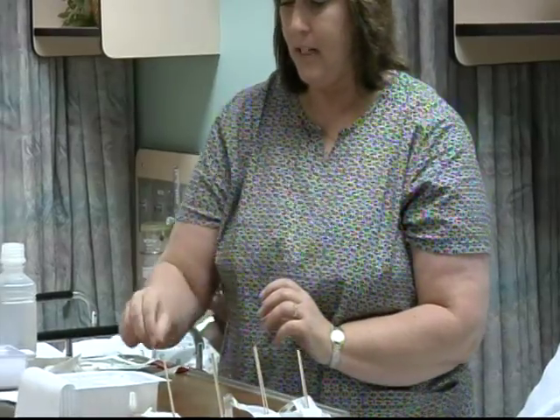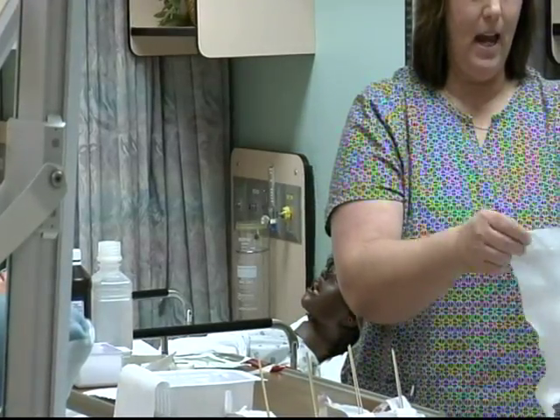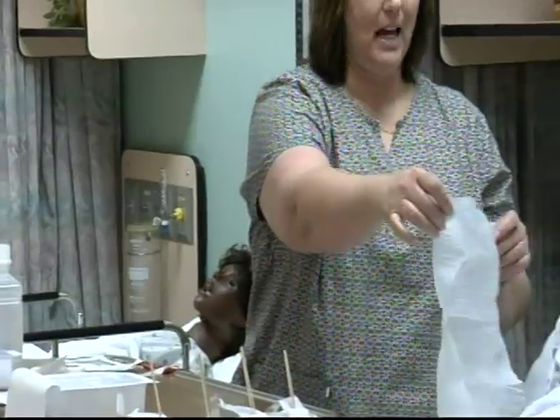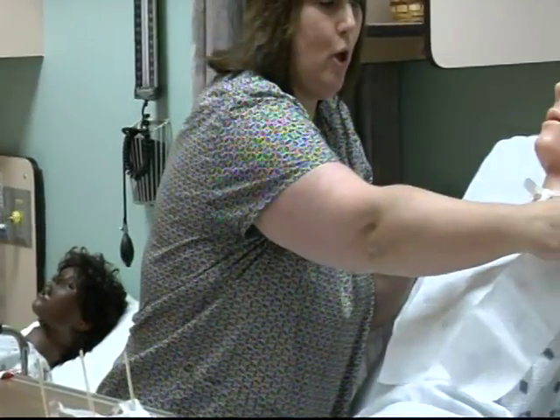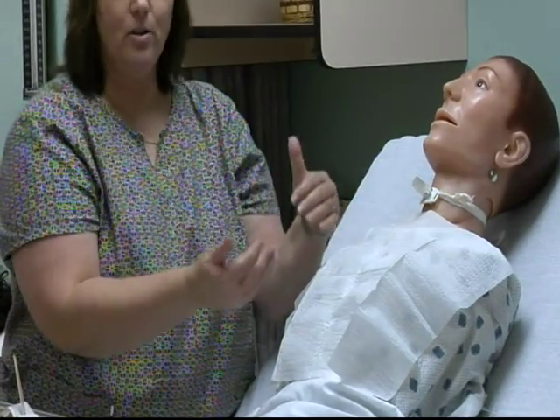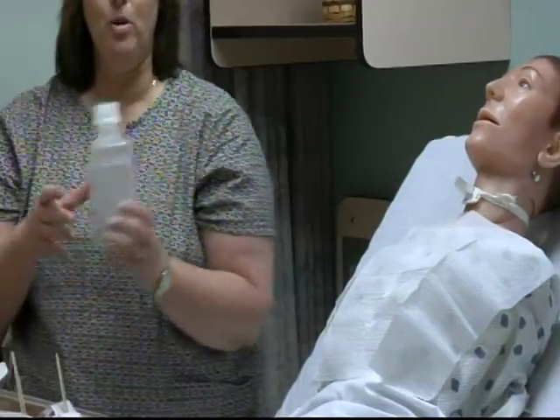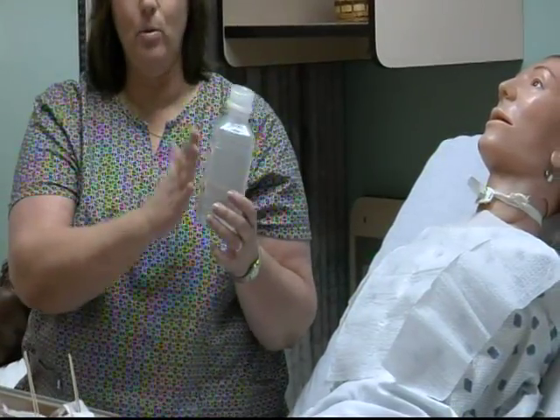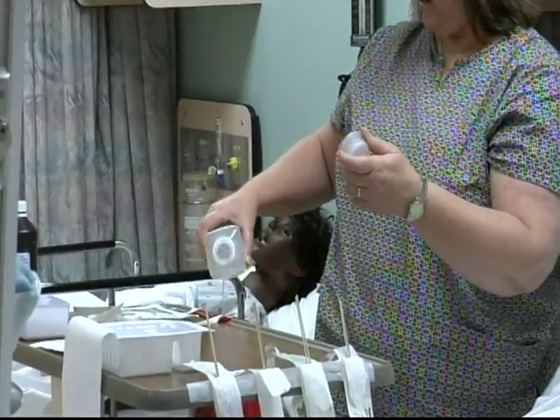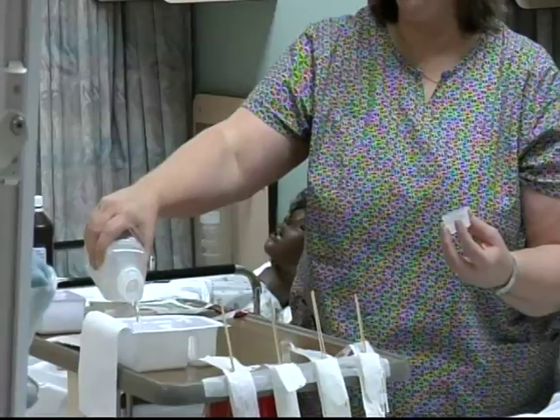Then take this little cloth out, and you can see there's a shiny side and there's a dull side. Shiny goes to your patient, because if you spill anything on them, it will not soak through your gown. All right, then take your normal saline, label to palm, lip it, and remember to lip the way that you're going to pour it. Pour a little bit into your back tray.